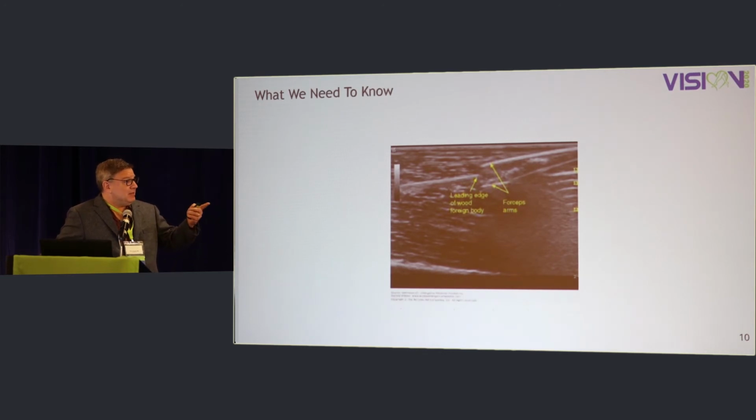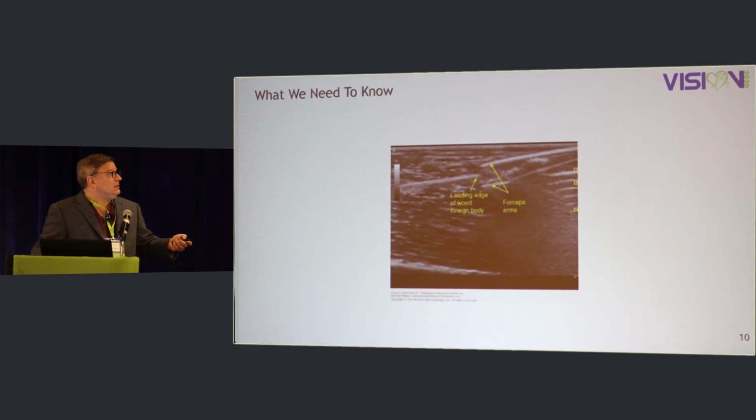Here's the example that, again, I didn't have my own pictures at the time, but you're going to see that little mosquito just being able to reach in and grab that foreign body. You're going to watch the whole thing come out, and then you follow it up with an x-ray, and you've had control the whole time, so there's nothing proximal.